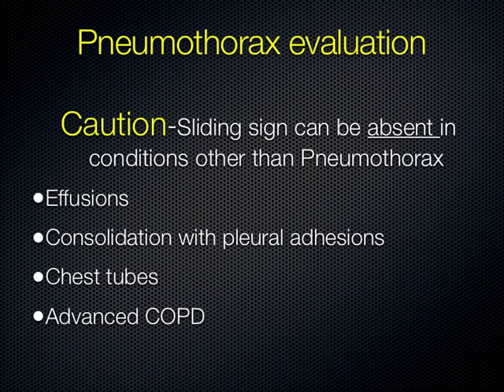when you go on M mode, you would still be able to see that. Seashore beach sign should still be there. But lack of sliding, be careful. If you see lack of sliding, don't make your diagnosis just on that. Okay?